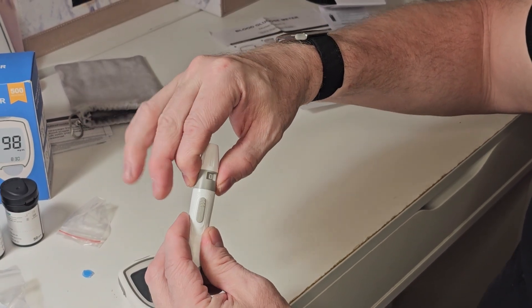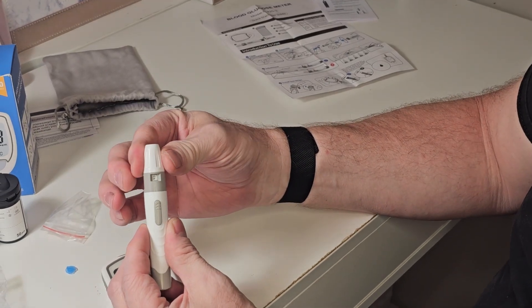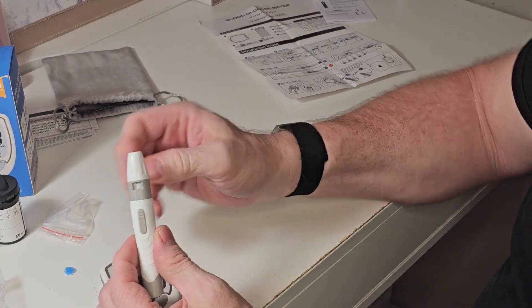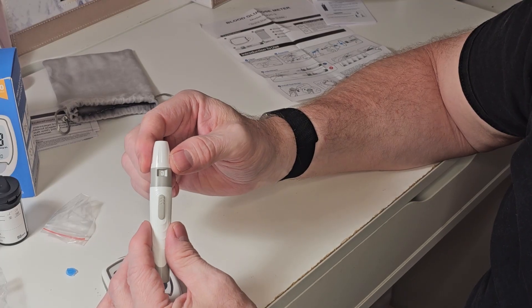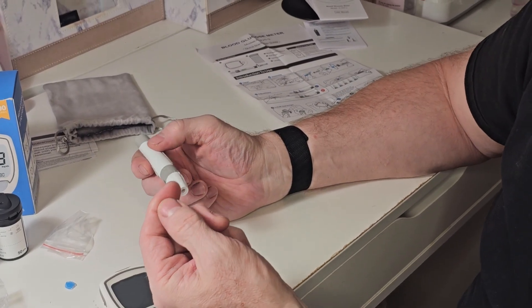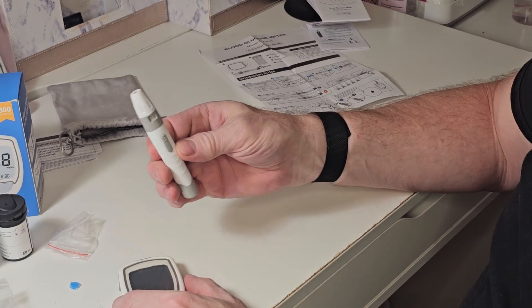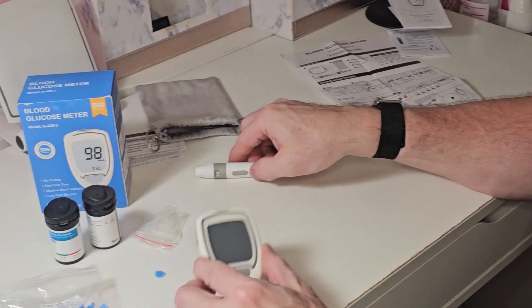Turning the top dial will determine the depth of how far the needle goes in. As a test I'm going to use depth two, since I don't have the thickest or thinnest skin. Make sure your hands are clean — you can do a quick alcohol swab if needed.